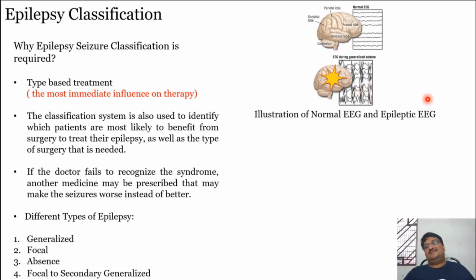Now the idea is how we can screen. As I mentioned, there are many thousands of patients per one neurologist. So which 100 patients should the neurologist see first? That is decided when you have a screening algorithm for epilepsy. How you can screen a particular patient for epilepsy is you will just observe the spike waveforms here. There are some patterns in the waveform which are a characteristic biomarker, a signature for a different type of epilepsy.